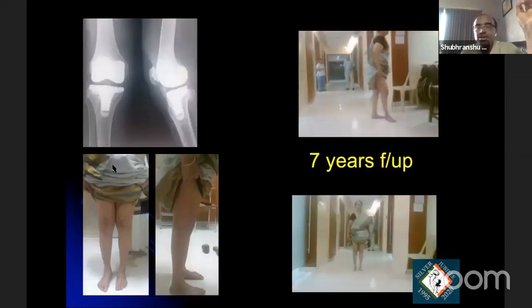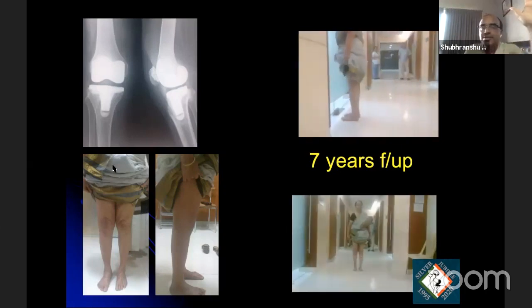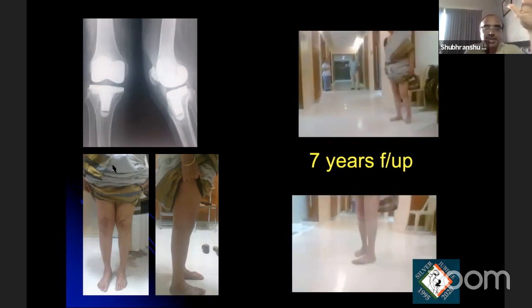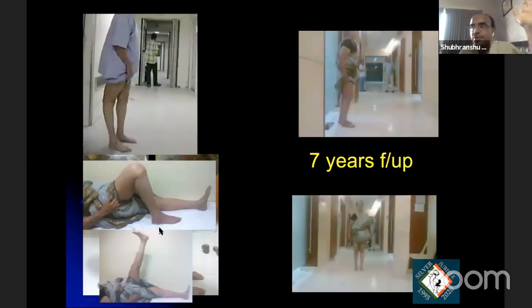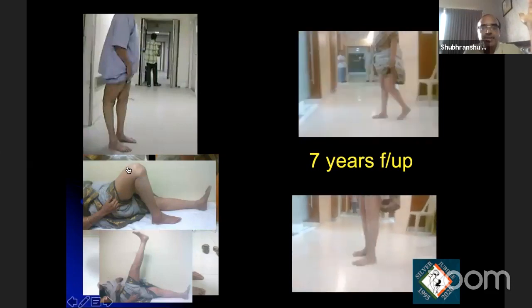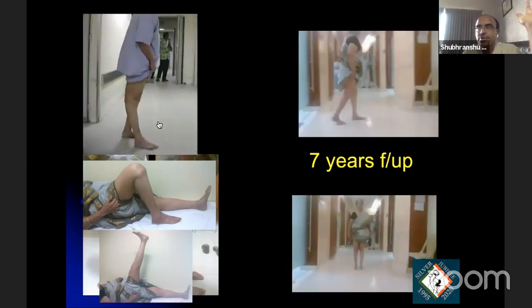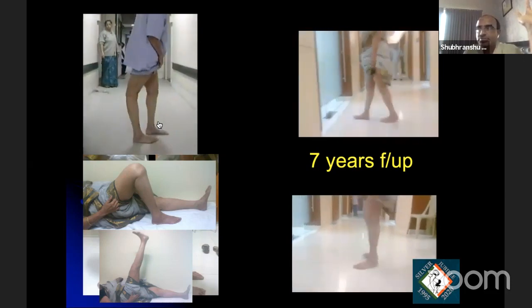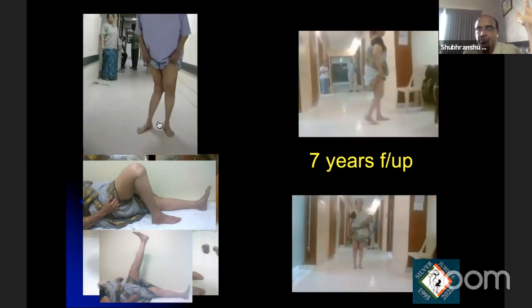This is the post-operative X-ray of the patient. We got away with the primary implants. That is the 7 years follow-up of this patient. As you can see here, the valgus is corrected, the hyperextension is corrected, and that is the amount of movement. There is no extension lag, and the patient who was walking like this pre-operatively had a normal gait after the surgery. So this is his gait before surgery, this is the gait after the surgery.